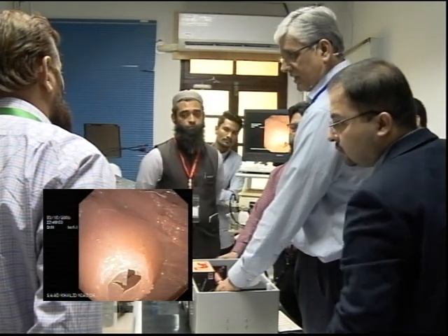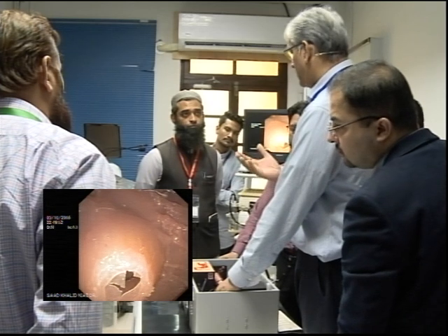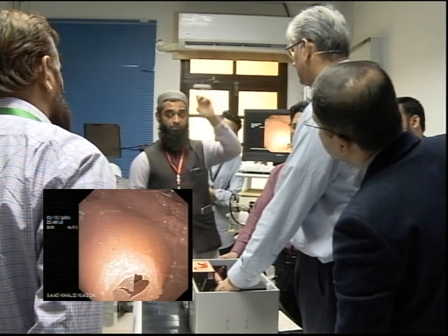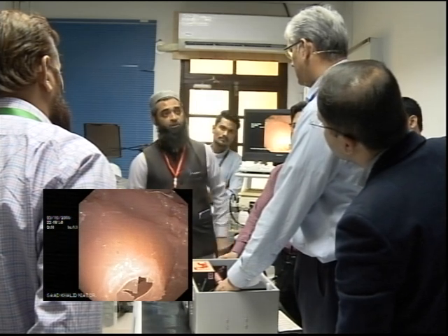Okay, right. And so for 11 o'clock, what do you have to do? Push in, make the ampulla at 1 o'clock, and go to cannulate.